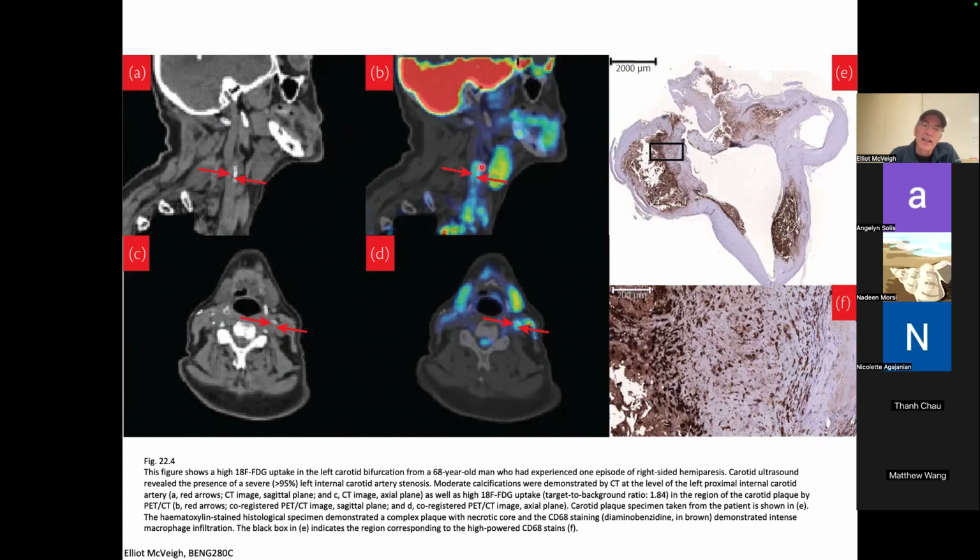But this is the interesting picture. This has high FDG activity in the vessel itself, right? And as you can see over here, we have high FDG activity in this vessel and not in the vessel on this side. One of the great things about human beings for radiologists is we're very symmetric, right? So you have your own control. When you're looking at a brain picture, usually there's a left and a right side, and in the brain they're perfectly kind of mirror images. So it's like, well, that shouldn't be there because it's not over there. It's an easy way to read radiology.